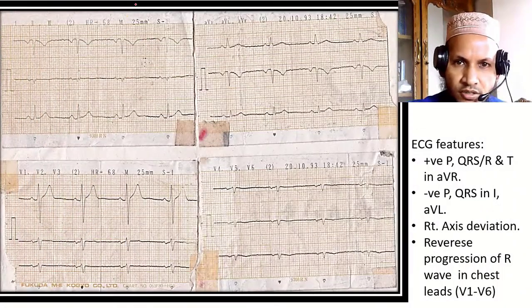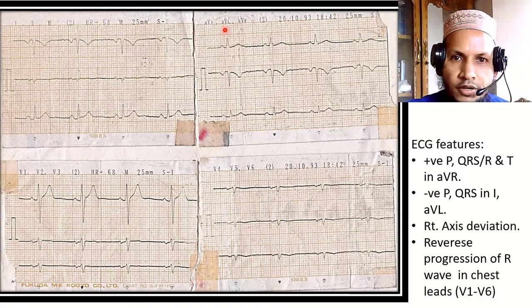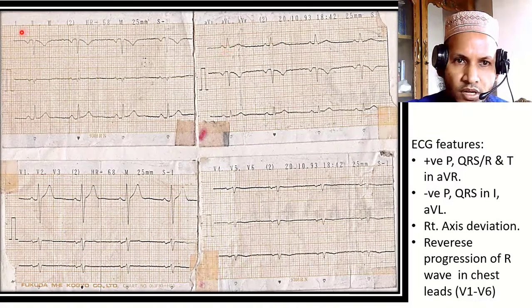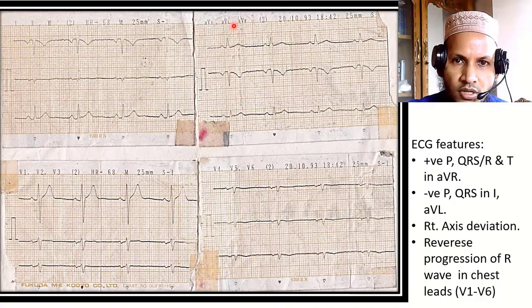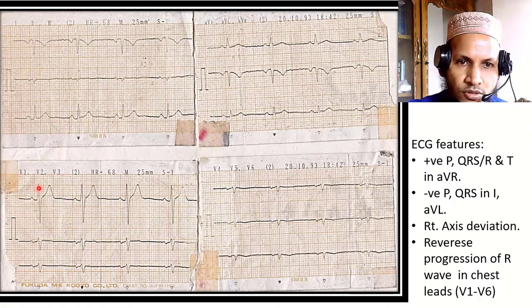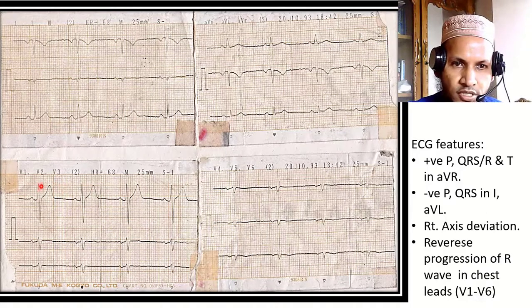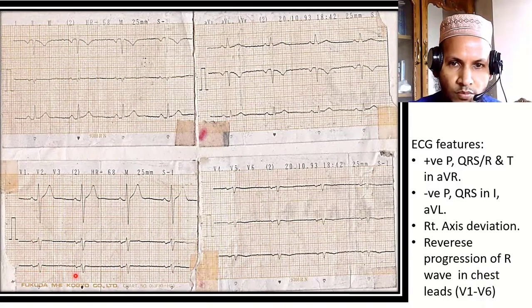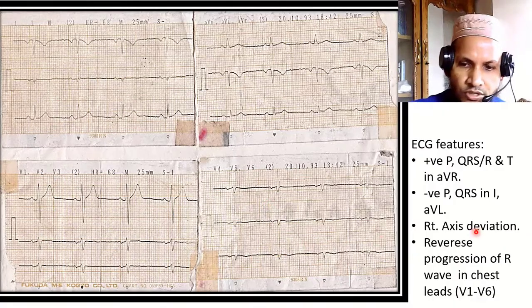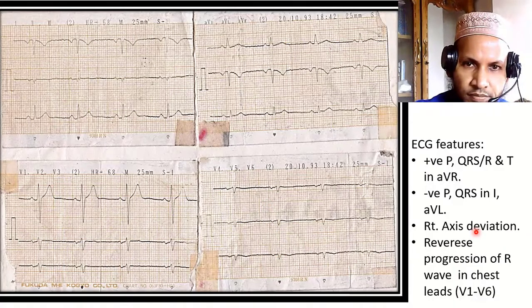Here is another ECG. We can see positive P and R waves in AVR and negative P and R waves in lead I and AVL, along with reverse R wave progression from V1 to V6 — the R wave height is gradually decreasing from V1 to V6. This is also true dextrocardia.